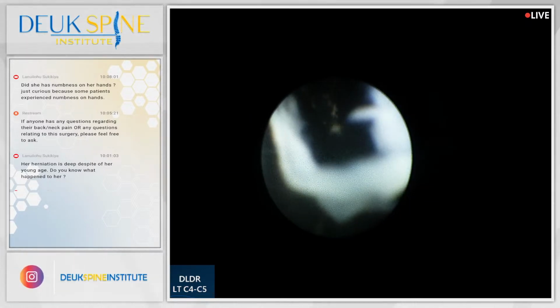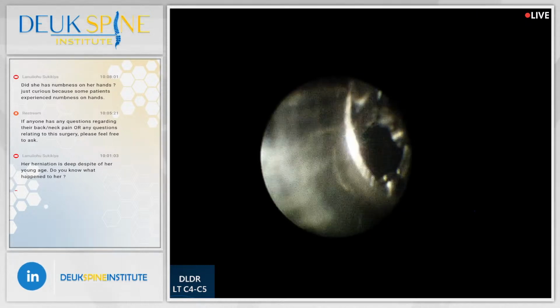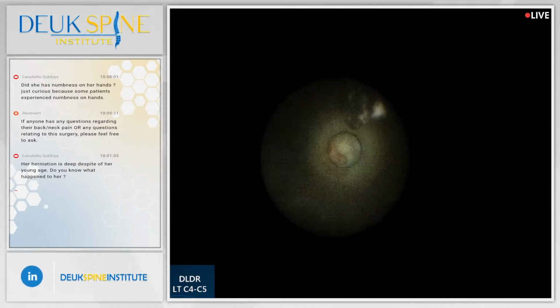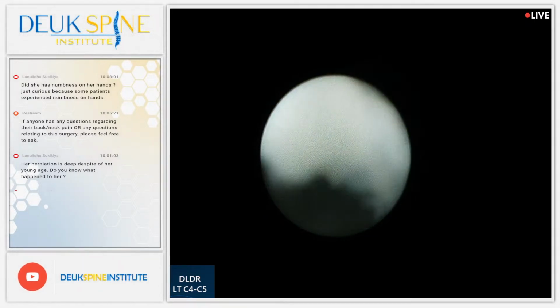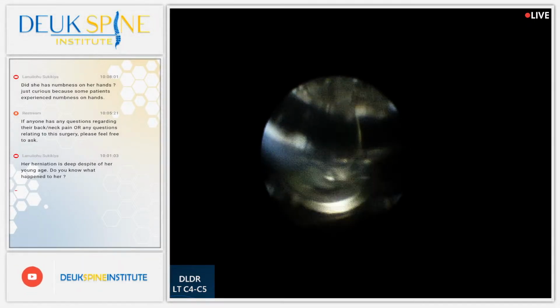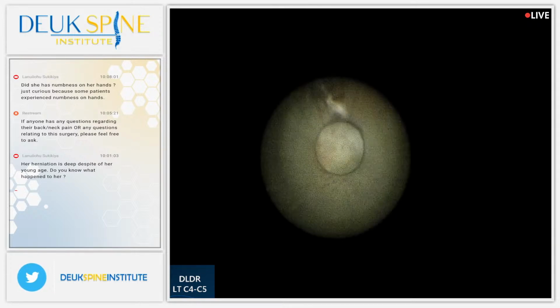We're not treating it. But the second most common cause of neck pain is facet joint inflammation, or inflammation in the facet joint. Again, there's another. These are all pieces of herniation. Remember, I told you there'd be about 30. That's our average. What we see is around 30.